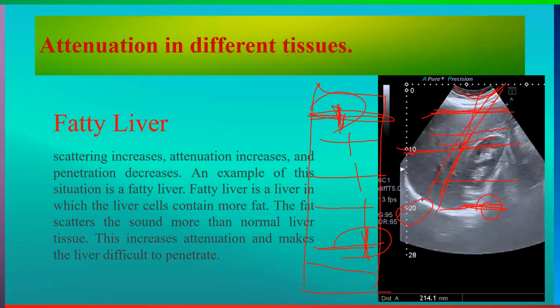But you will still have to use the TGC, because that artificial intelligence does not work perfectly. If you once activate the artificial intelligence for the enhancement of the image, then multiple other things will also be obscured.